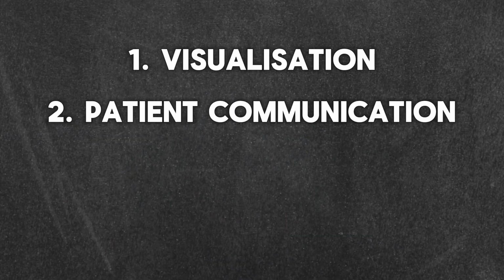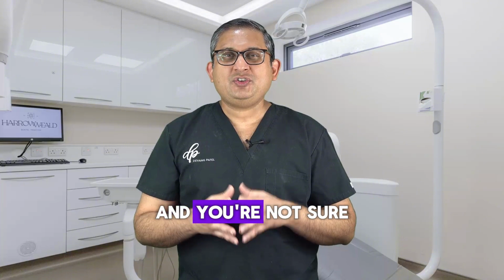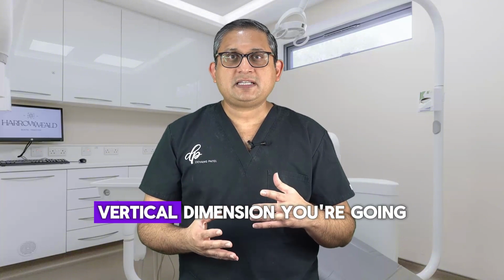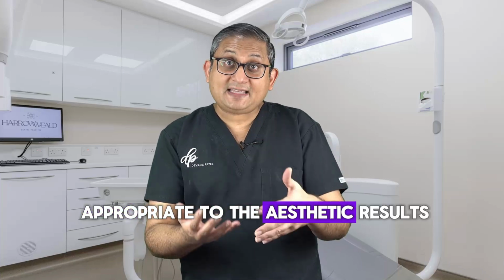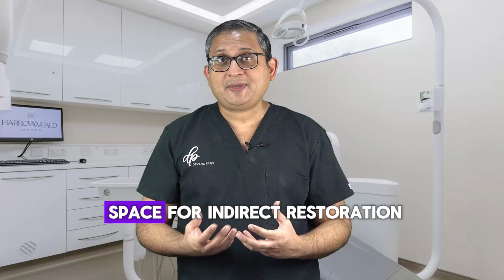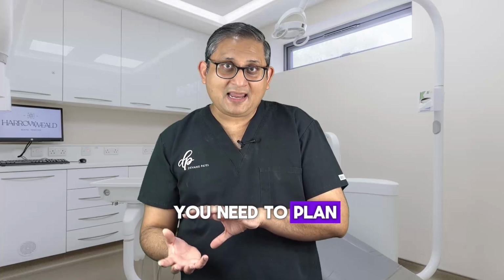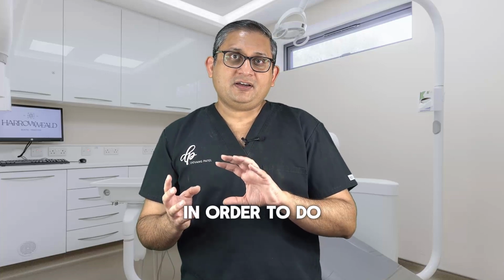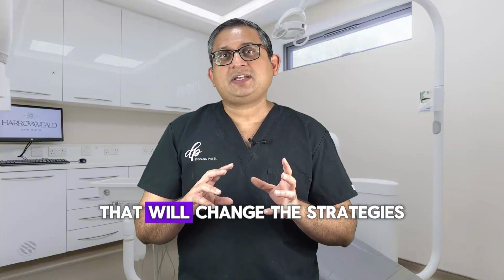It will help you with planning as well. So when you are doing a treatment plan and you're not sure how much occlusal vertical dimension you're going to raise, and you just raised appropriate to the aesthetic results, but then for the posterior restoration, you don't have enough space for indirect restoration. And then that means you need to plan that area in order to do direct restoration, and that will change the treatment plan, that will change the strategies.